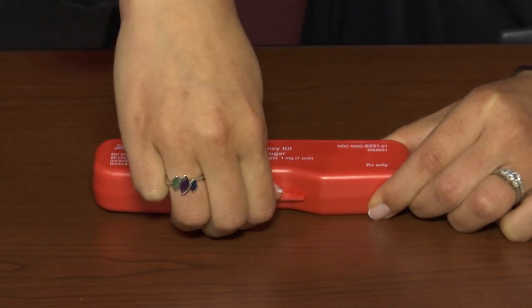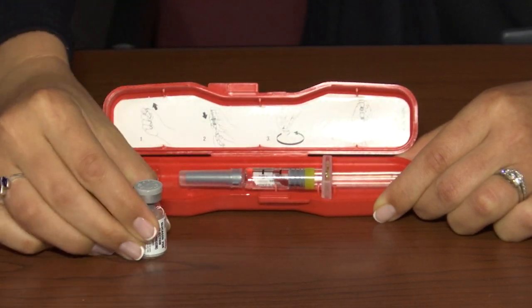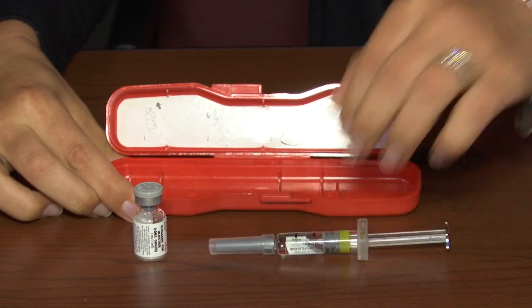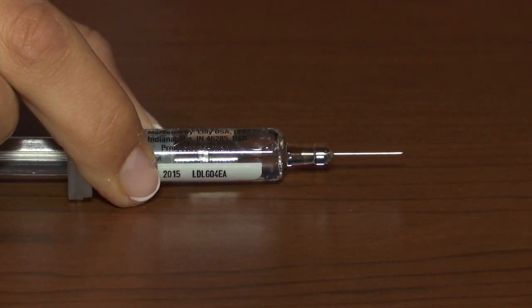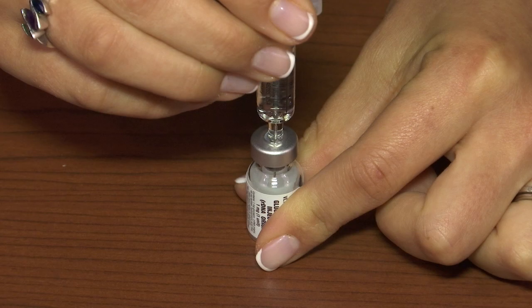To administer the Glucagon, open the plastic emergency kit. Remove the vial of sterile Glucagon powder from the kit. Next, remove the syringe filled with the sterile liquid from the kit. Remove the cap from the vial of powder and the needle cap from the syringe. Inject the needle into the vial of powder through the rubber top.